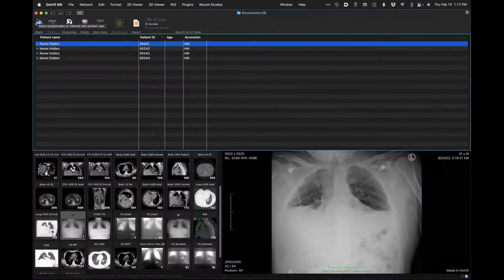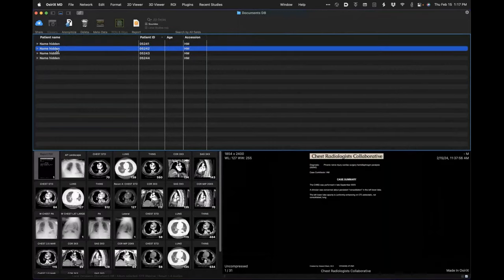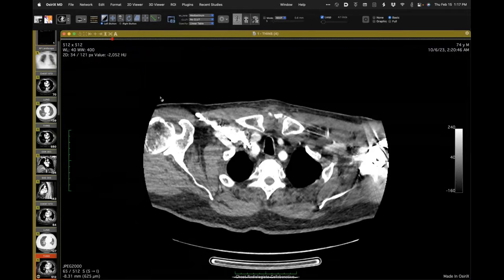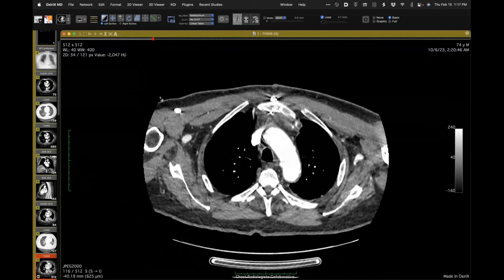Let me show you this case. A pulmonology colleague referred a patient with the question: there's opacity and consolidation in the left lower lobe that's persistent on imaging and I don't know why. Left lower lobe consolidation is ostensibly the pulmonologist's concern.